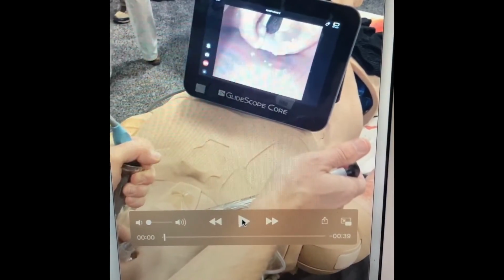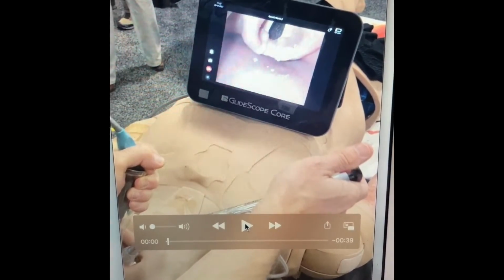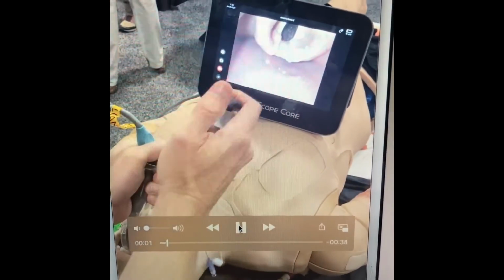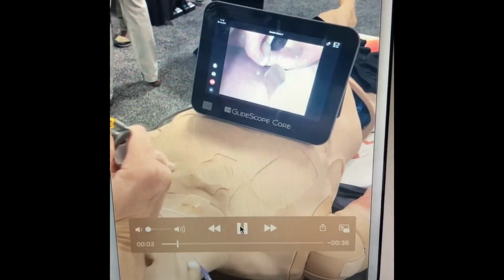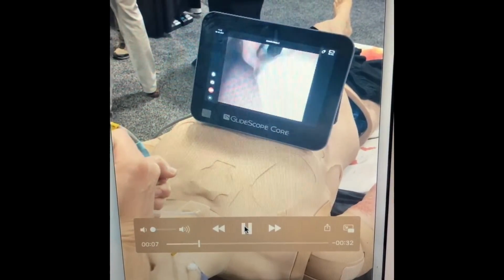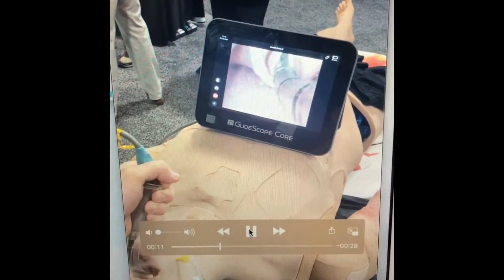Okay, here's another video where there's commotion in the background, just like there would be in any code or intubation typically. So you have to focus on what's going on. You can see we're going to enter and be a little bit posterior, and this is very typical. Try to manipulate with my thumb, put the ET tube up a little bit, which drives the end of the tube up, and sometimes you can go right in.